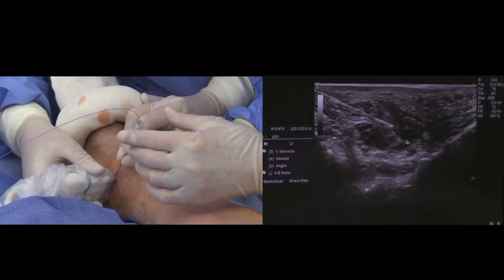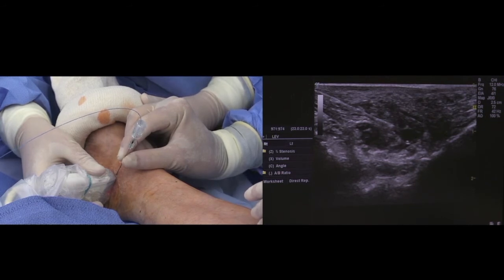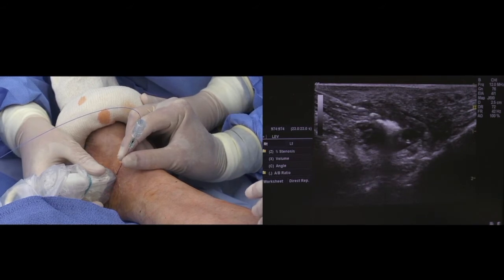I want to start the laser. You shouldn't feel anything, okay? So we'll watch our numbers. Any pain at all?